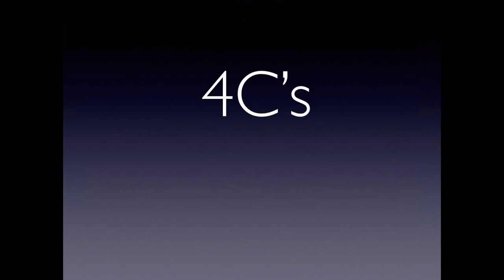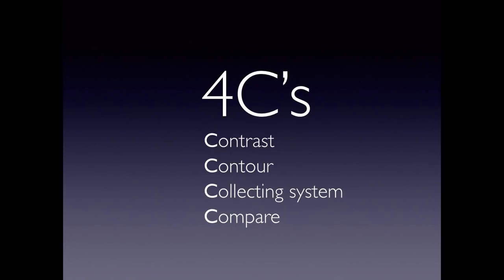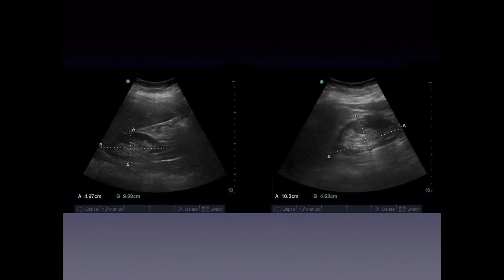A helpful framework for renal scanning is the four C's: contrast, contour, collecting system, and compare. Look at the grayscale contrast of the kidney, the contour for any masses or cysts, the collecting system within the renal sinus, and then compare both sides for symmetry. Normal kidneys should be about 9 to 12 cm long and 4 to 6 cm wide.